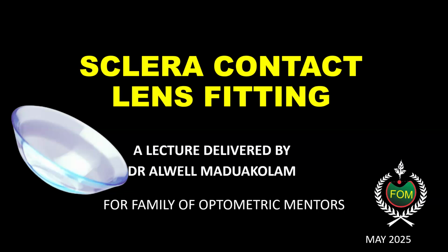Fantastic. Thank you. What was your experience, Dr. Osazee, in fitting the scleral contact lenses? Well, at first, my major challenge was the size of that lens, because you're looking at a lens of about 18 mm, 20 mm, 18 to 24 mm. It's really a challenge. But at the end of the day, I had it fitted on me, and I also fitted it on someone.